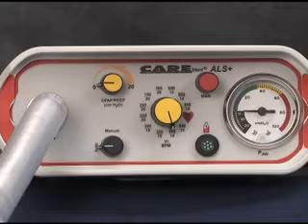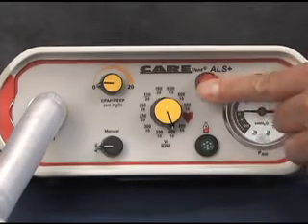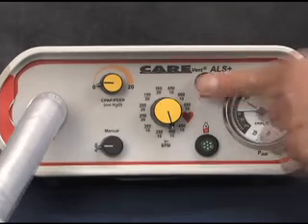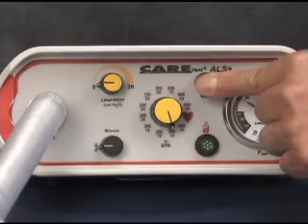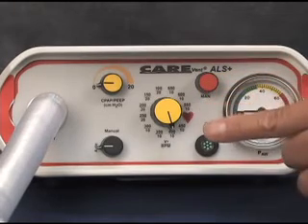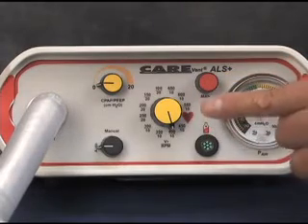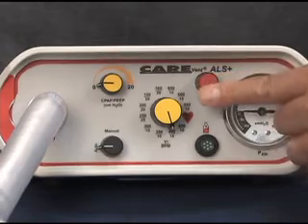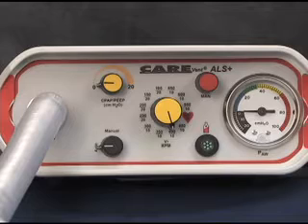At any time during automatic ventilation, the operator may override the automatic cycling by depressing the manual ventilation override button. This will cause the automatic cycling to cease, to enable the provision of chest compressions in line with the current resuscitation guidelines. It can also be used to provide assisted ventilation to the spontaneously breathing patient. The manual gas flow is equivalent to the setting selected in the rotary setting selector control. If the rescuer fails to continue to actuate the manual ventilation override button, the ventilator will recommence automatic ventilations at the preset rate and volume.